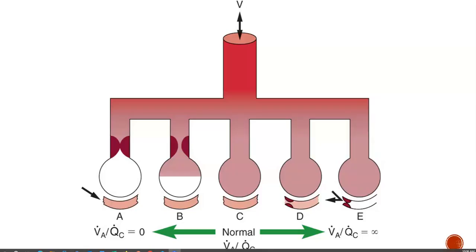So when we drop those ET tubes, we want to be mindful of where the carina is and where the ET tube is in relation to it. We're going to talk about that in a little bit, but I wanted to mention it. It's very important. It's usually 2 centimeters or so above the carina where you want the tip of your ET tube to sit. An ET tube is an endotracheal tube.